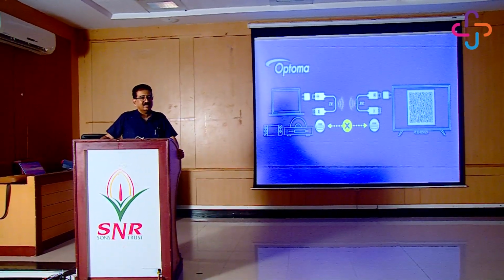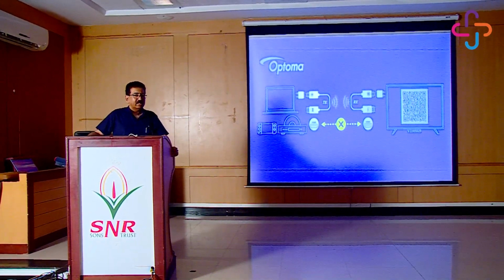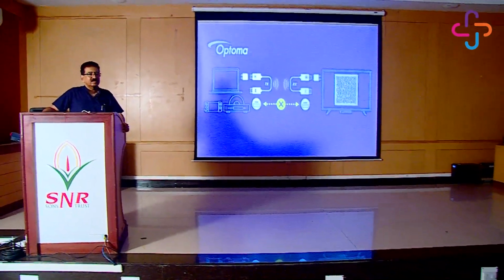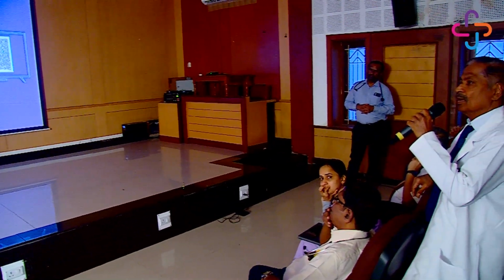You are employing 180,000 rotations per minute. Per second. And 100 atmospheric pressures. 100 atmospheric pressure is with the lithotripsy balloon. What we saw, that shockwave lithotripsy.